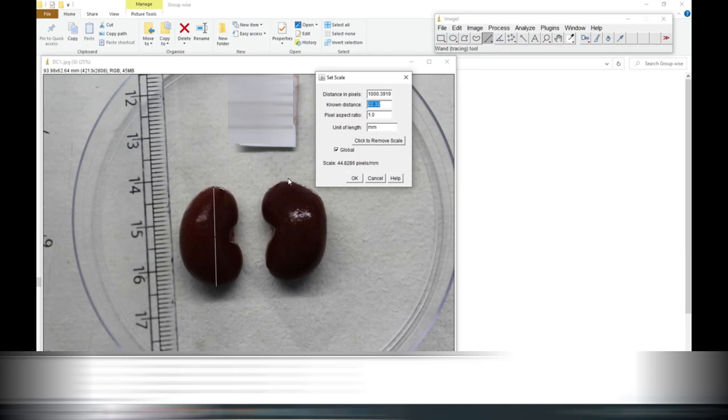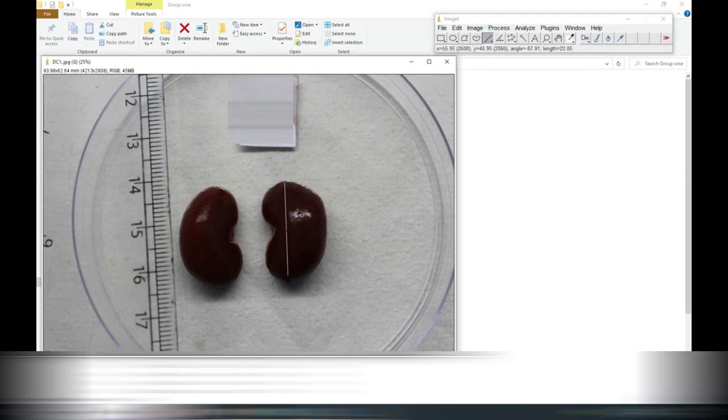You have to say okay first. Here you can again select the another kidney.